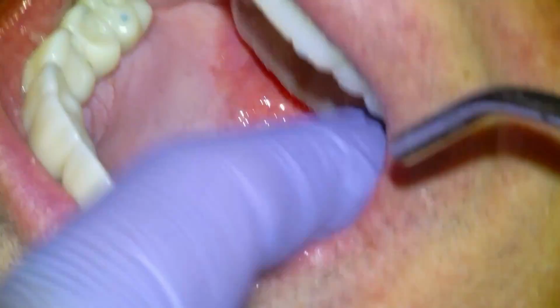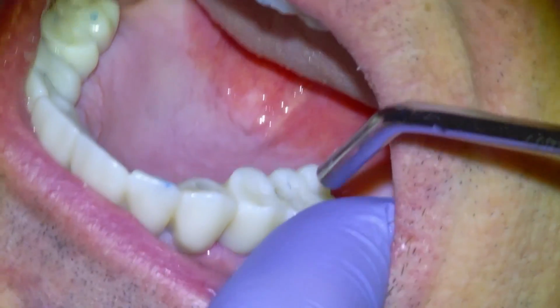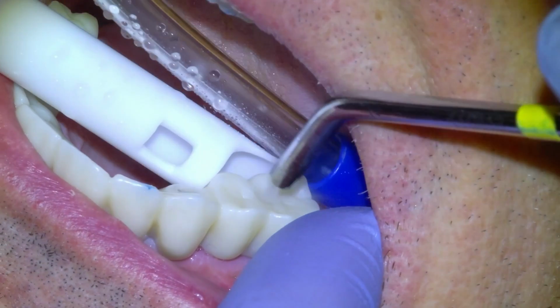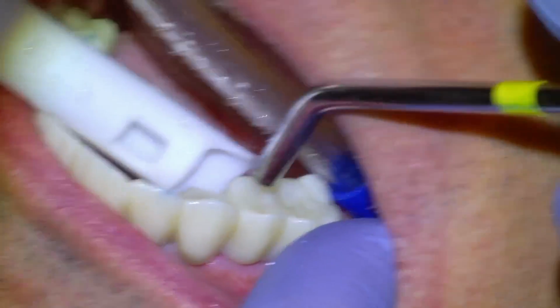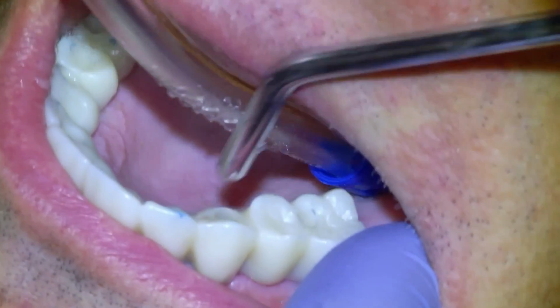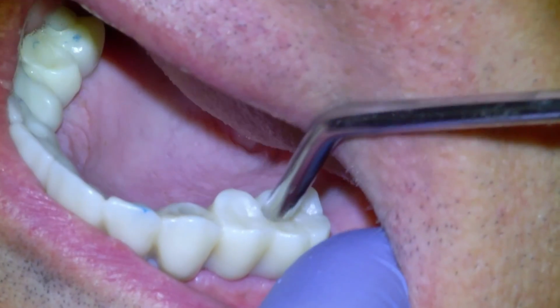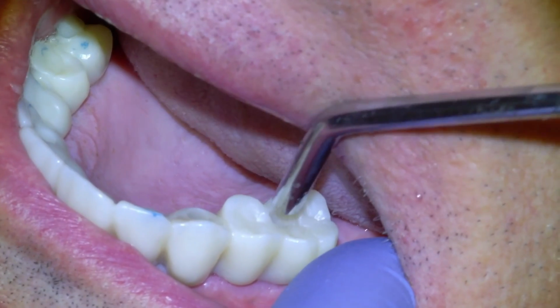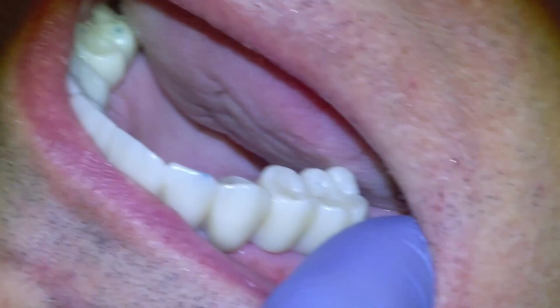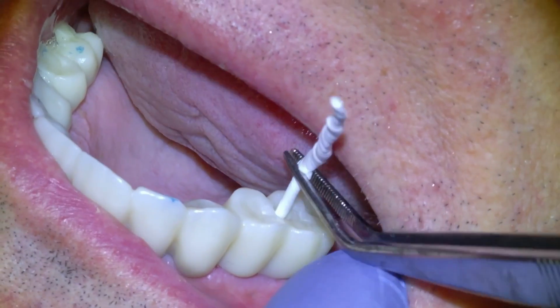In this case, actually, we didn't have to make any bite adjustments, which is kind of rare, but it's always nice when that happens. And then once we're happy with the bite and how it looks, then we're going to plug up the screw holes. So we will rinse and dry them thoroughly, and then we actually pack in some Teflon tape first over the screw head.